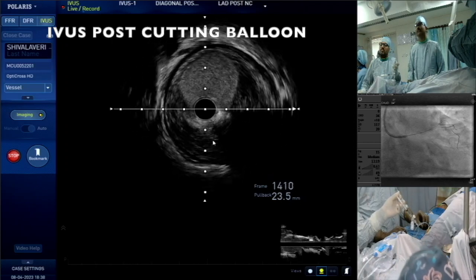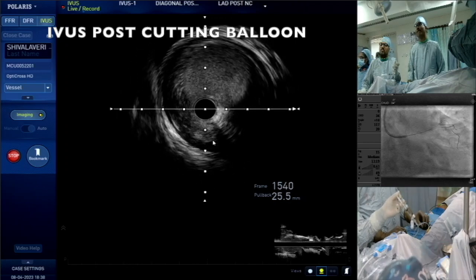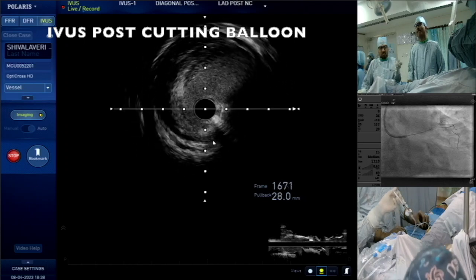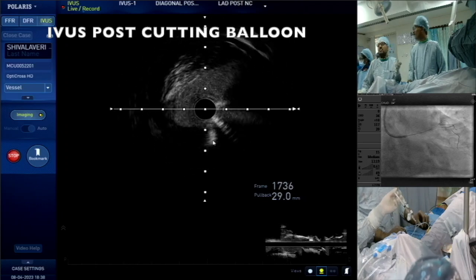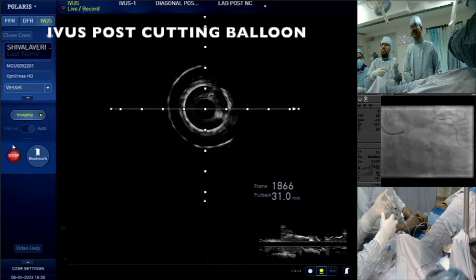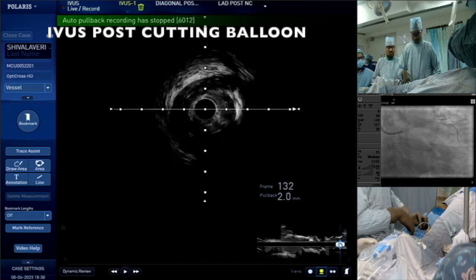It's going to be a soft block in the LMCA. Okay. Stop. It's in that. Stop. It's in guide, right? Stop. So now, we'll show you some trick of.